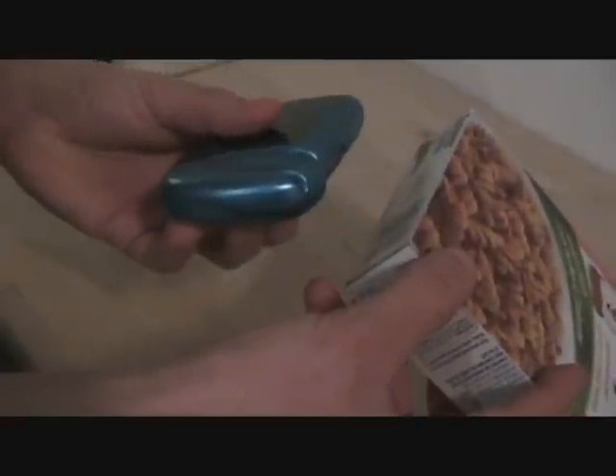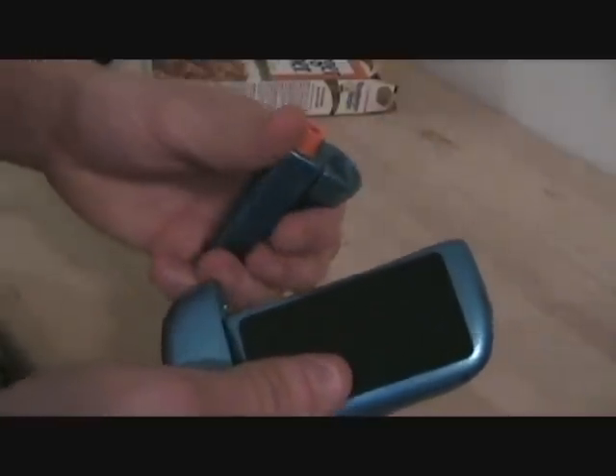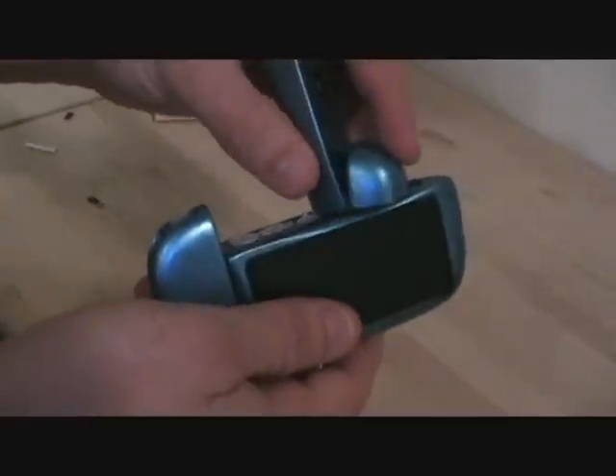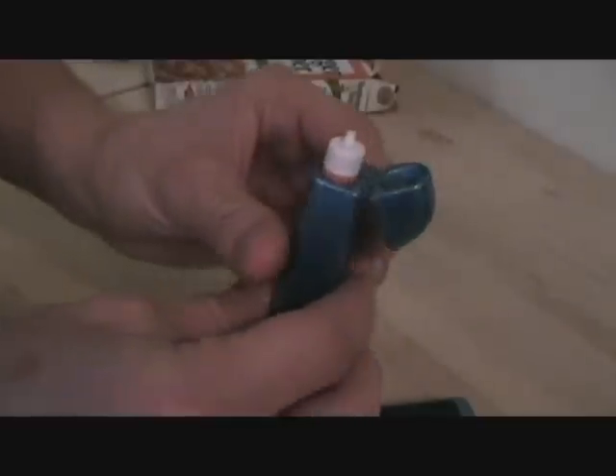The food item is then scanned, and the device will automatically calculate how much insulin is required. The insulin pen then gets detached and clicked into the side of the device to snap on a new pen fill needle. The user then twists off the cap, dials the required dose, primes the insulin pen, and then injects it into the arm.